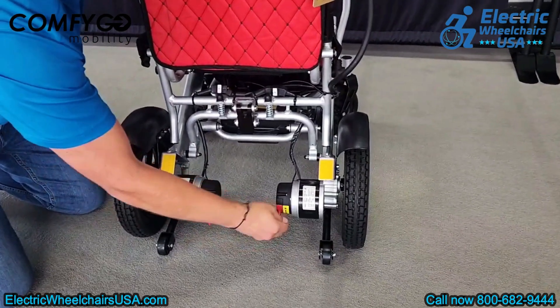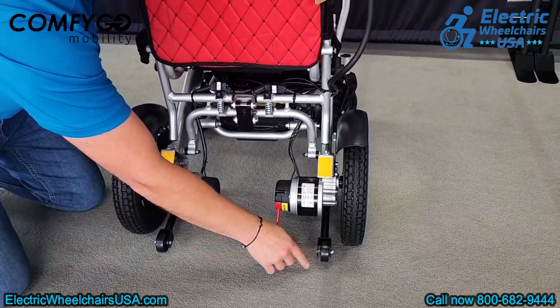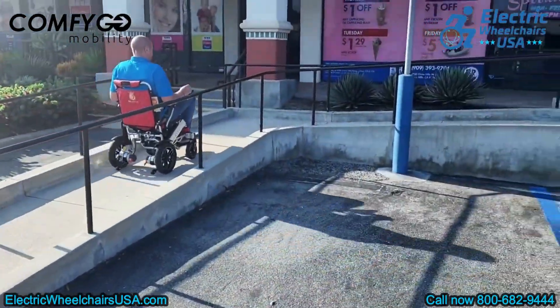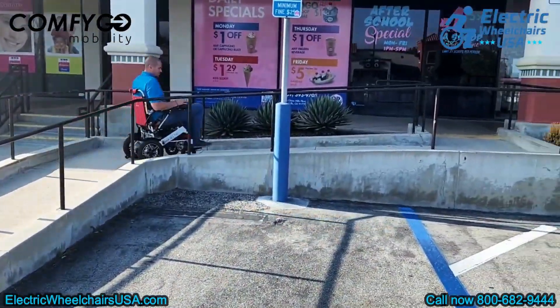The chair also comes with two rear anti-tip wheels that can be adjusted. These wheels provide extra stability when navigating steep inclines, preventing the chair from tipping backward.